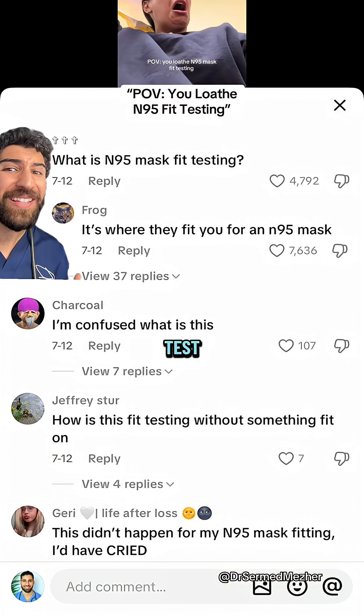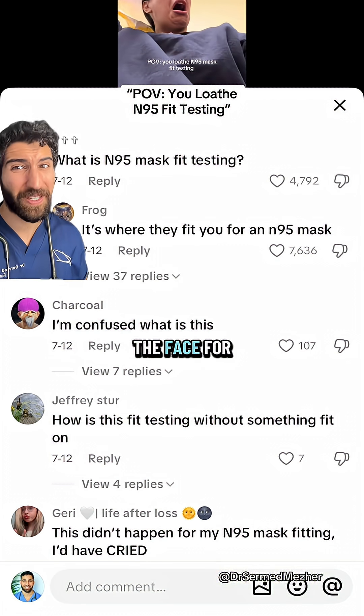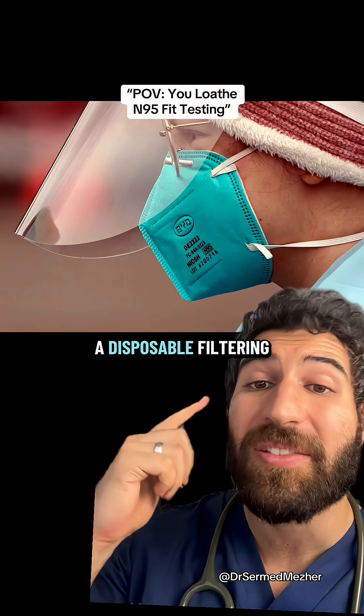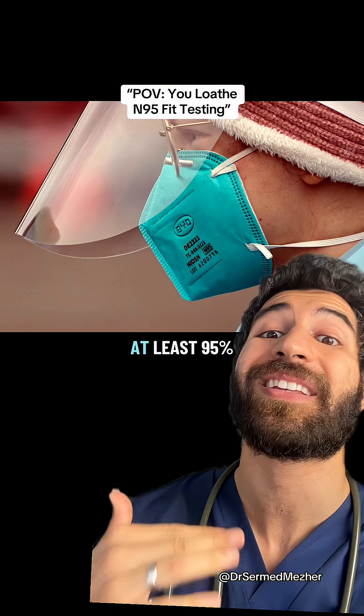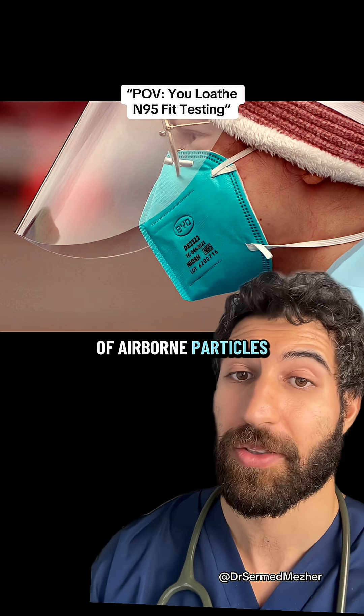What is an N95 mask fit testing and why would you need to be sprayed in the face for it? The N95 is a disposable filtering face piece, and the N95 stands for filters at least 95% of airborne particles.